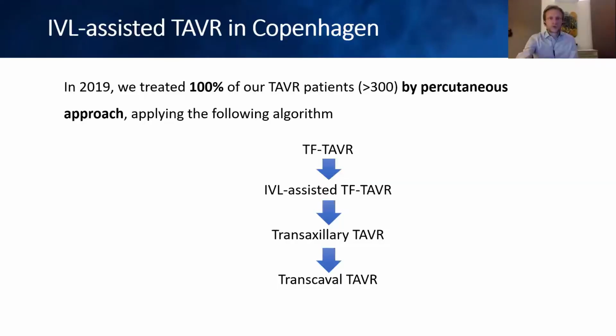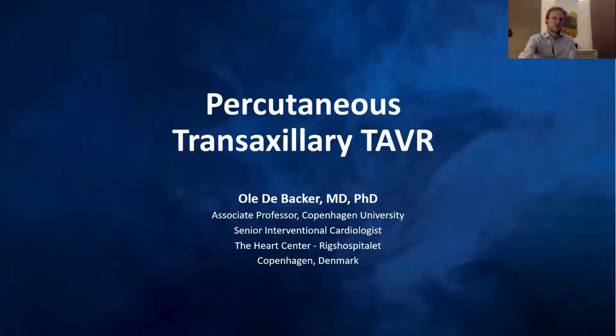Sorry, I go back. So in 2019, we treated, as said, 100% of our TAVR patients by percutaneous approach. Our algorithm: we try to see if a patient can be treated by regular transfemoral approach. If not, we see if we can consider intravascular lithotripsy assisted transfemoral. If this is not possible, we will look for the transaxillary approach. And if this is not an option, we look if transcaval could be an option. So in this way, I go further to the percutaneous transaxillary approach, which I think I can immediately continue on.